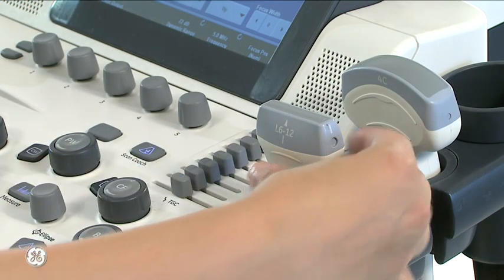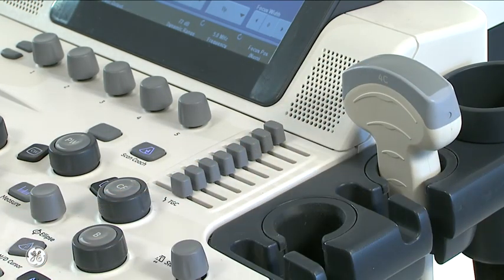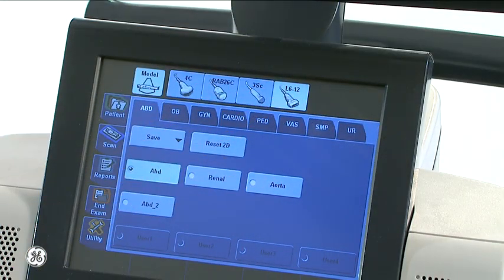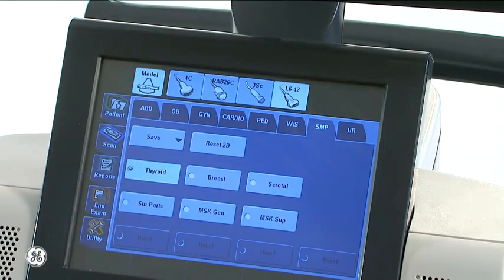The elastography feature can be used on a linear array probe. In this example, we will demonstrate a breast scan. Select the Small Parts preset and then Breast in the submenu.